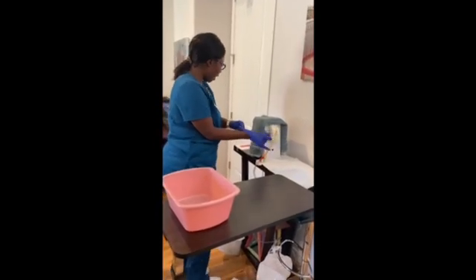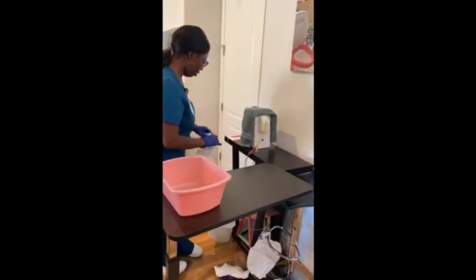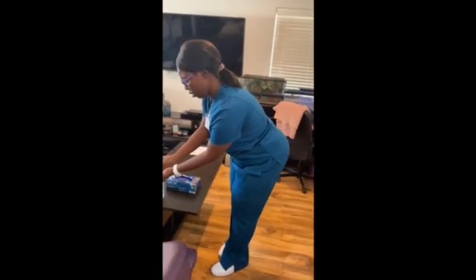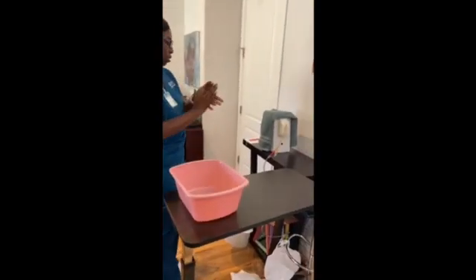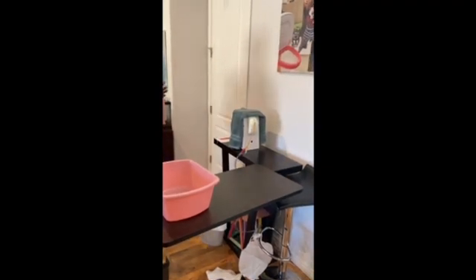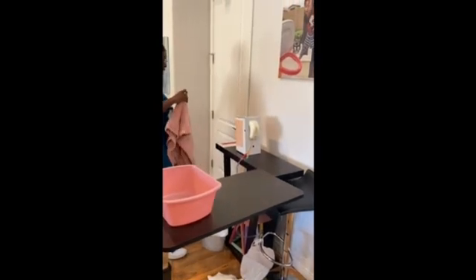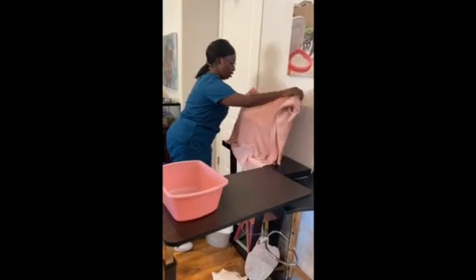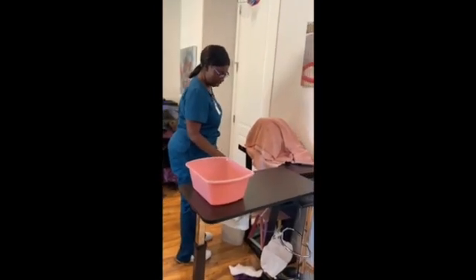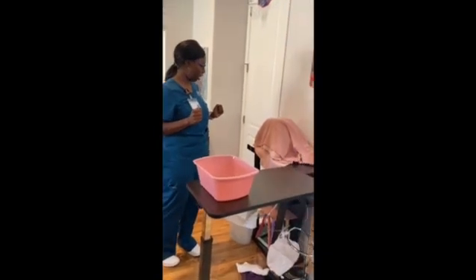Okay, Mrs. Taylor, if you can go ahead and lift up your hips one more time for me. Thank you so much. That also goes in the trash. Donning off dirty gloves and perform hand hygiene. I am going to remove the drape that was on the patient, cover her back up, put the side rail back up, lower the bed, check the room for safety. Everything looks good. There's no hazards around the patient.